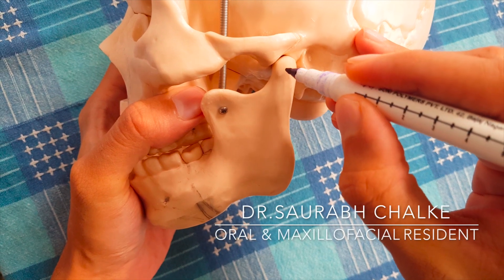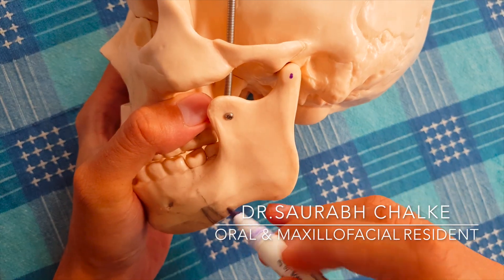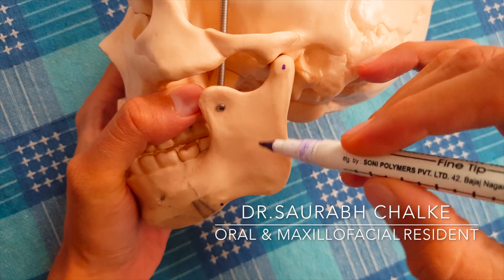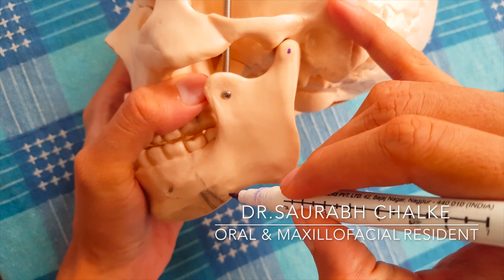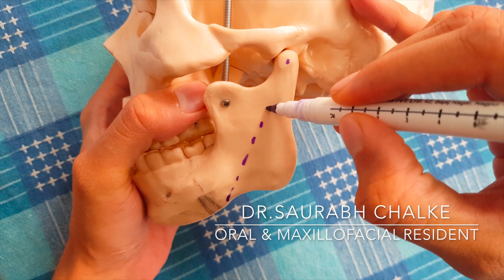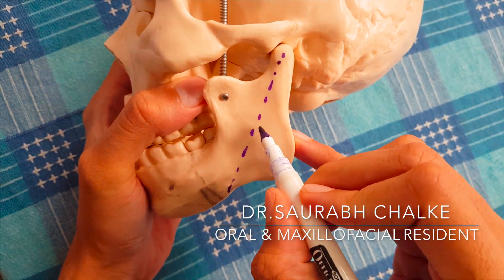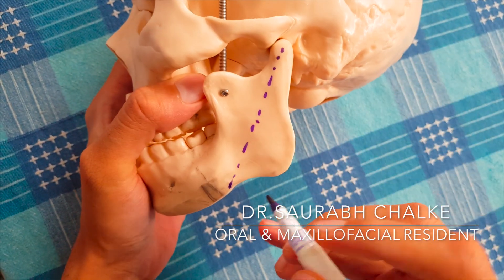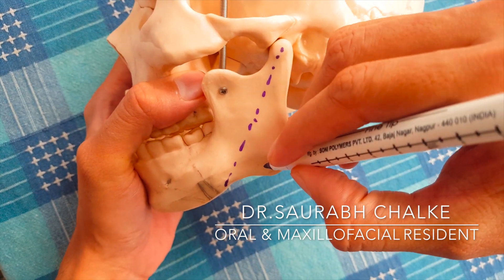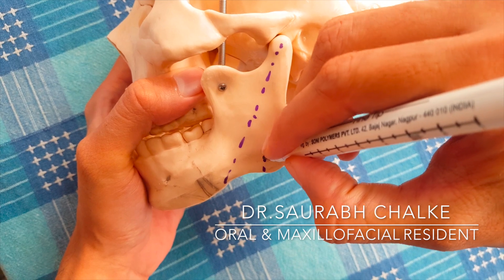Mark a point at the center of the head of the condyle. Mark another point on the inferior border of the mandible just ahead of the anterior surface of the masseter muscle. Join these two points and make a line. From the center of this line, draw one line which is parallel to the posterior border of the ramus and on the inferior border of the mandible.